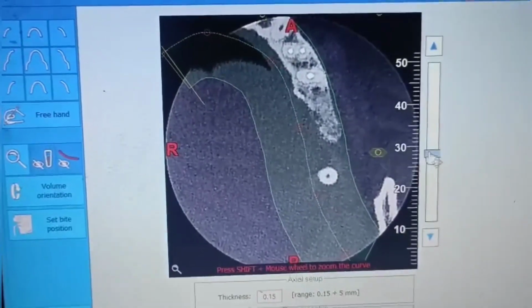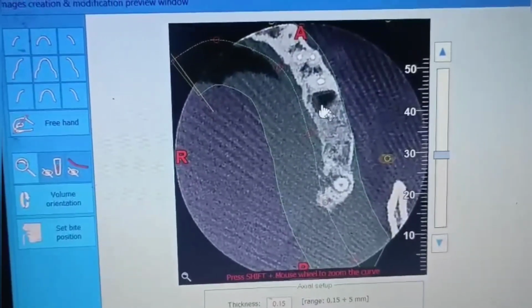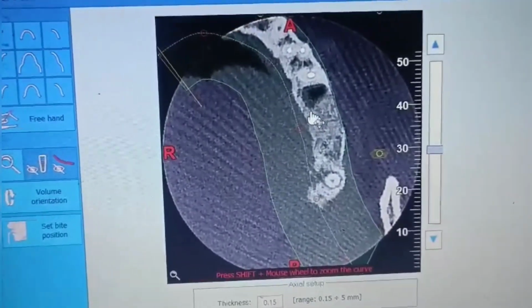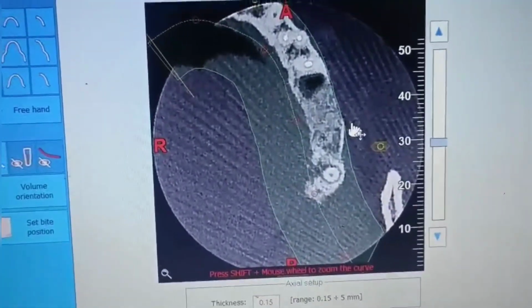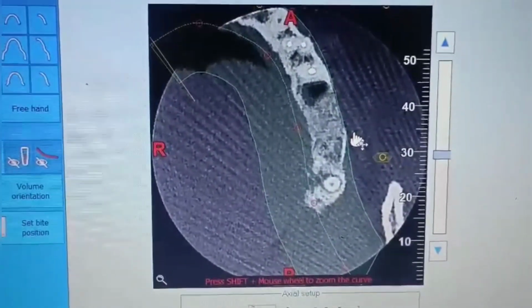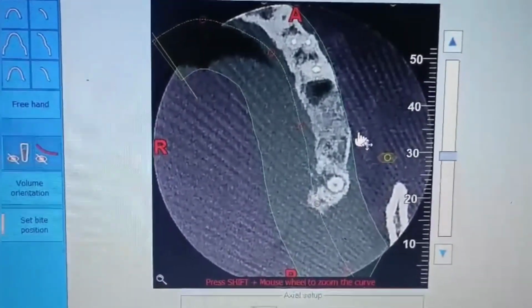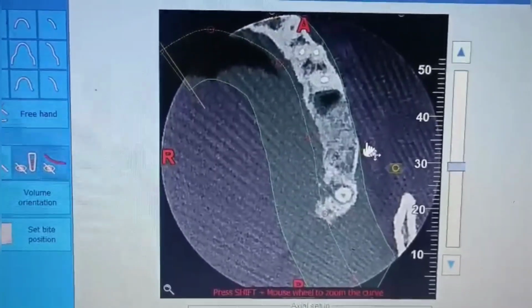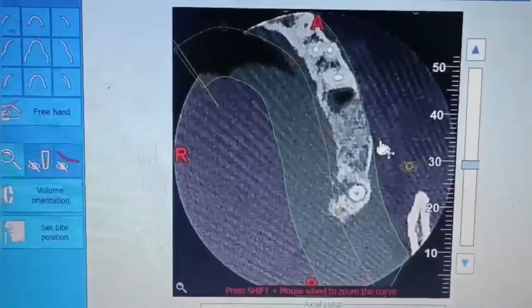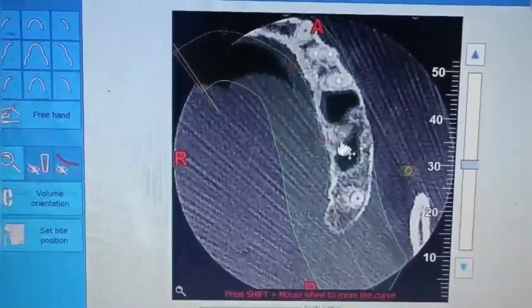So our plan is to have an implant placed in this region, probably around 8 mm distal to the premolar and towards the palatal side, and if possible without raising much bone, exposing the periosteum, or even raising a flap. So we planned for a flapless surgery in this case, which could be done right on the spot with minimal drilling and maximal expansion, so that this palatal side will be expanded towards both the sinus regions.